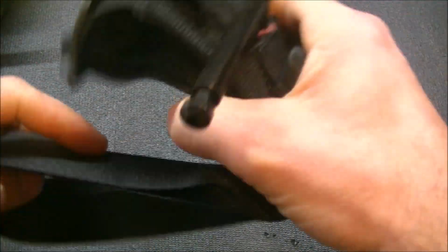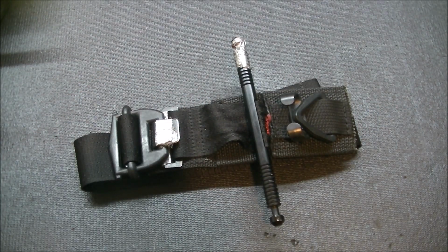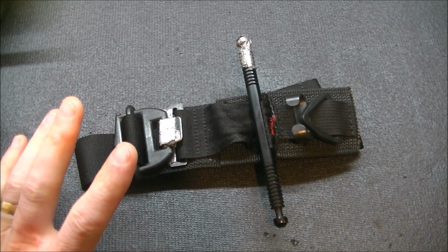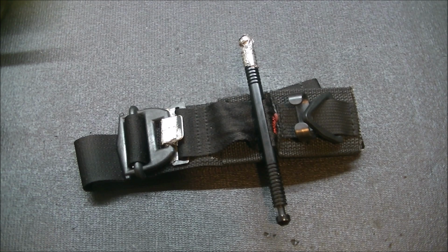Now, let's look at the cons. As I alluded to earlier, it can be very hard to get this off once you apply it one-handed, but getting it on one-handed is difficult enough. It is very difficult. When you tighten it down really hard, you're going to get 1 and 2.5 turns maybe, if you're lucky, and you're going to struggle to get that third one on.